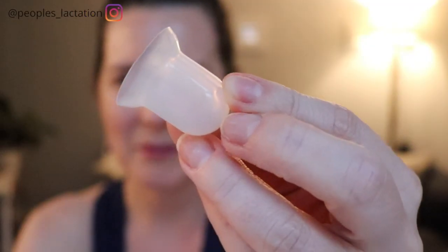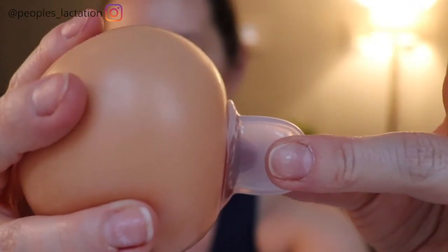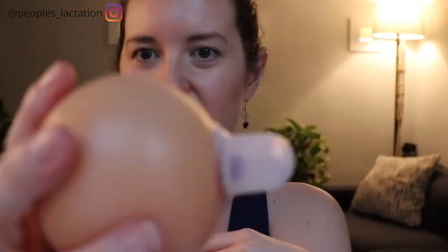So that's what a supple cup looks like. A supple cup works by just squeezing, placing it over the nipple, and releasing. On a real breast, it's going to stay on and extend the nipple up into it.